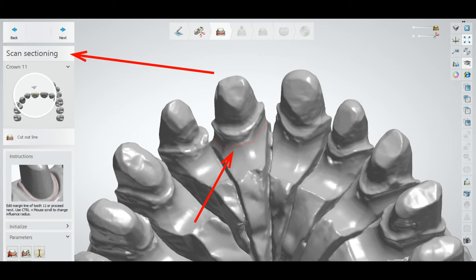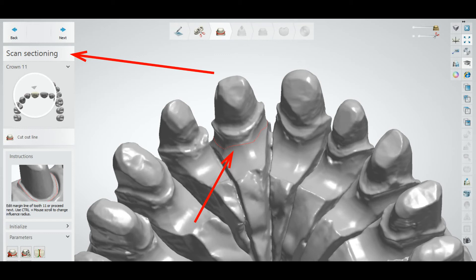In the design, the first step is the scan sectioning. Just section your scans. If it is a full arch, if it is a one tooth, just make a section. Then save your order and close it.